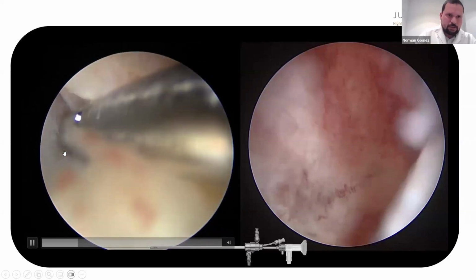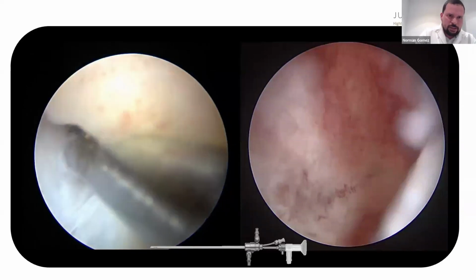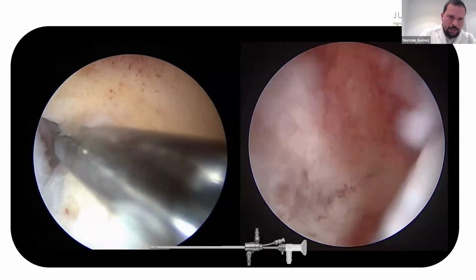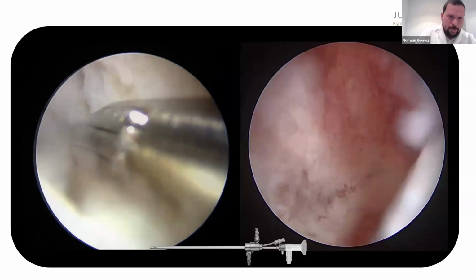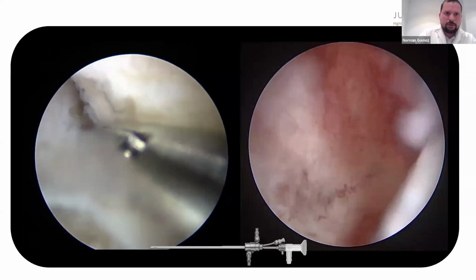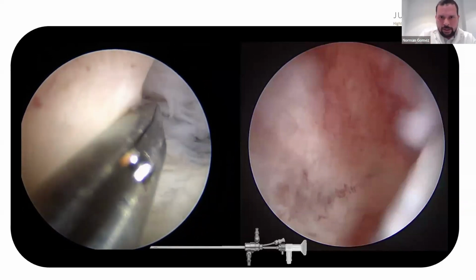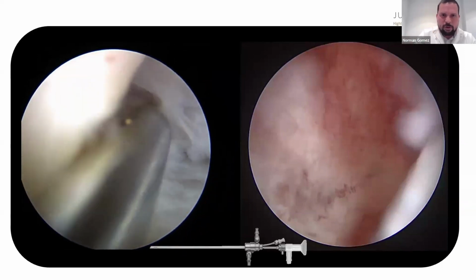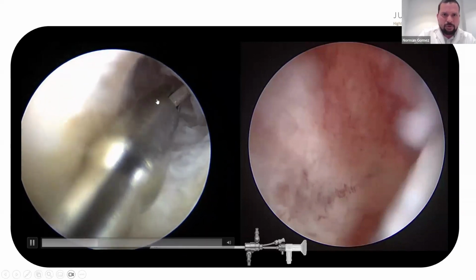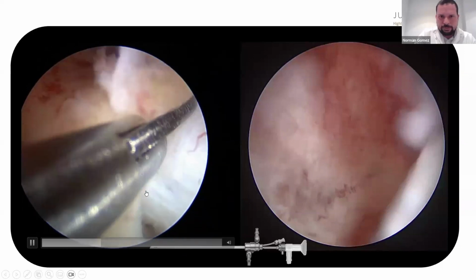It's the same operation every time that you do this kind of work. You can go inside the pseudocapsular plane with the help of the scissor, and rotating the scissors, you can cut and separate very well the pseudocapsular plane and detach the fibroid from all the surrounding attachments.